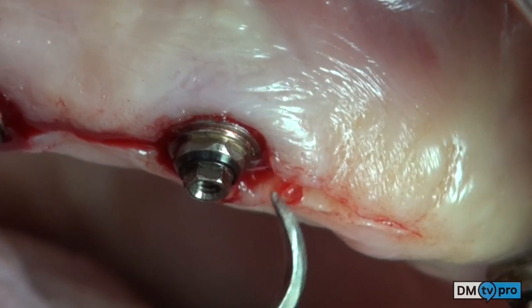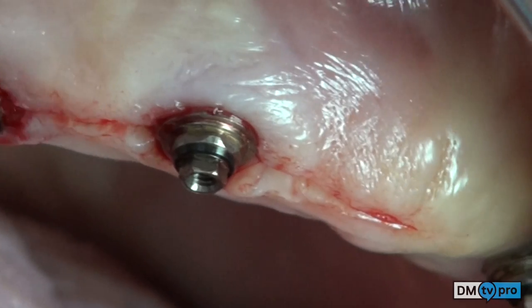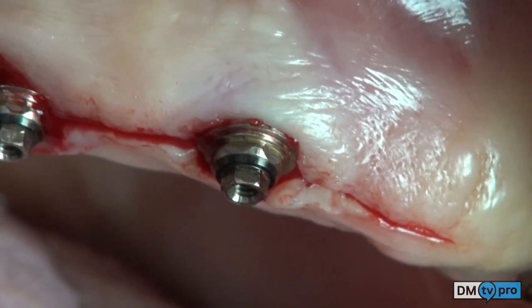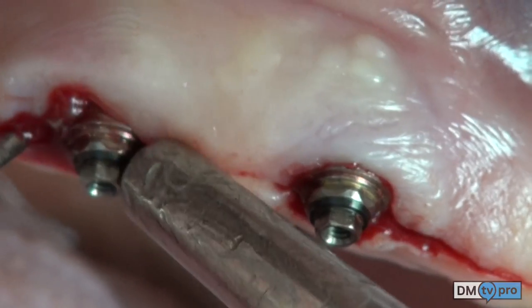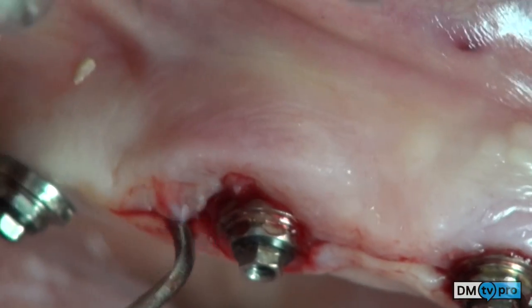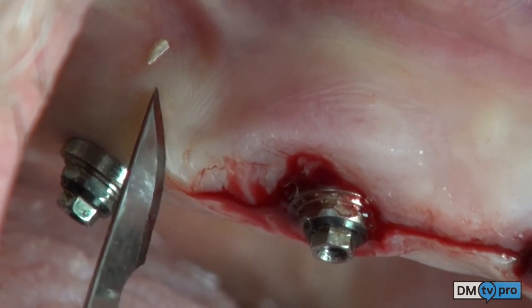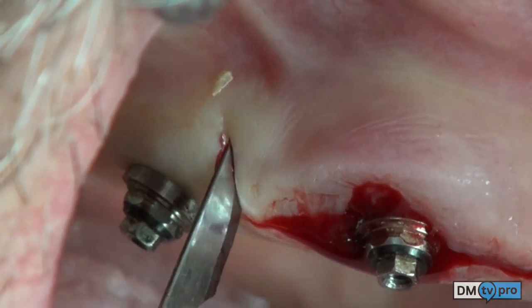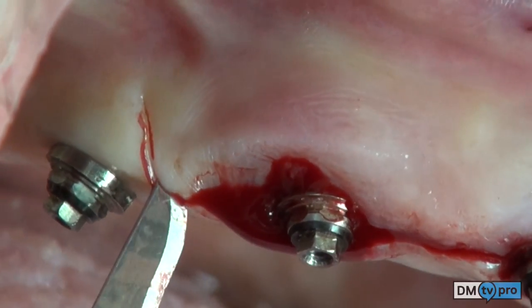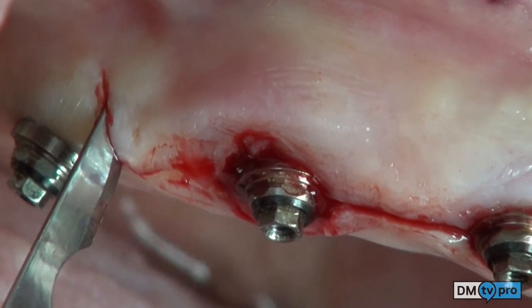With the tip of an M23 scaler, the soft tissue is detached from bone, allowing an easier elevation of the flap. Two small vertical releasing incisions are performed on the mesial and distal aspect of the crestal incision.